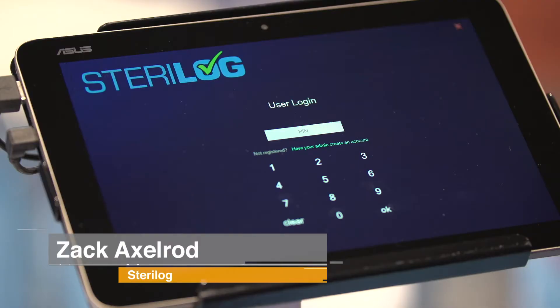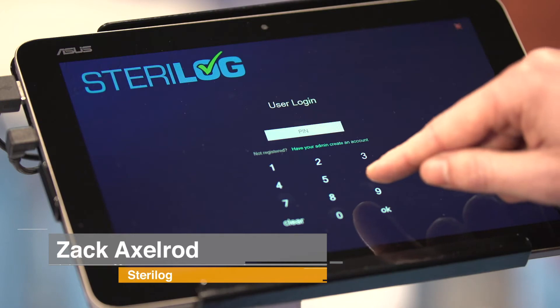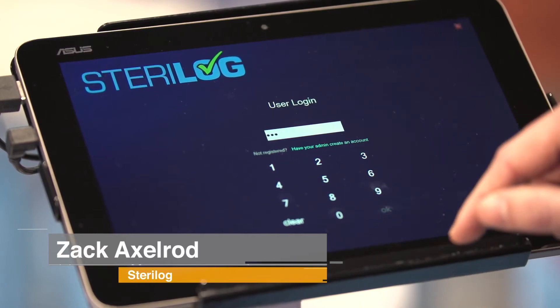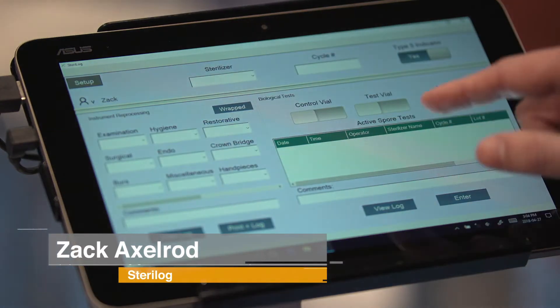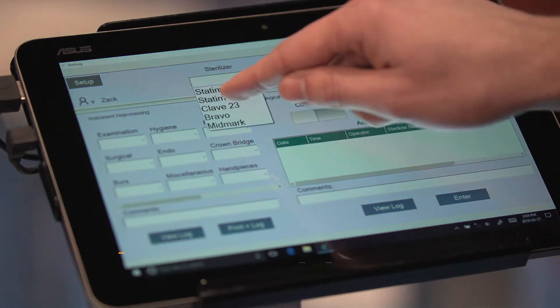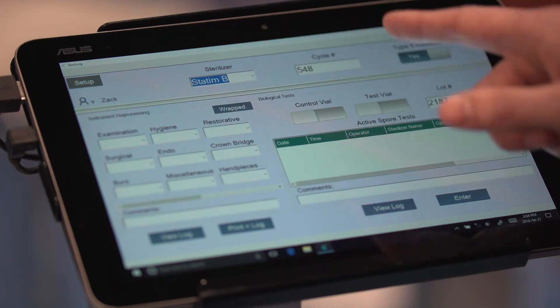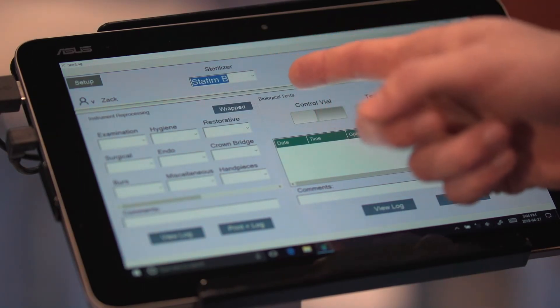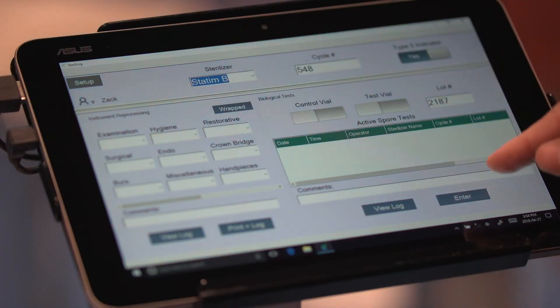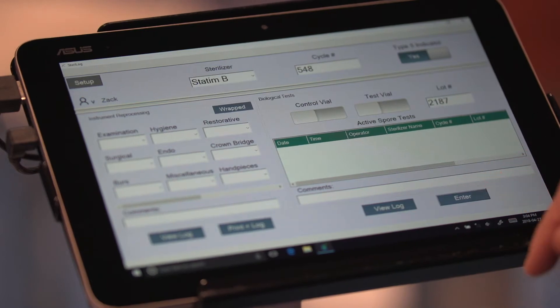I'm going to log in here with my unique PIN and start by entering my first biological indicator of the day, along with the sterilizer, the cycle number, and the pre-populated lot number.